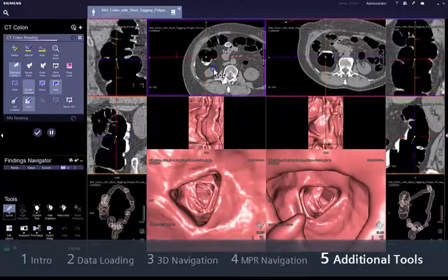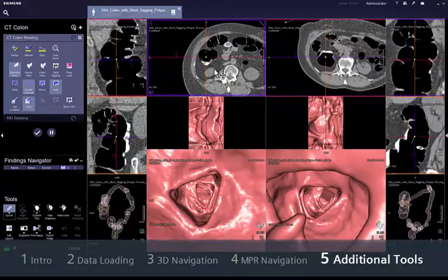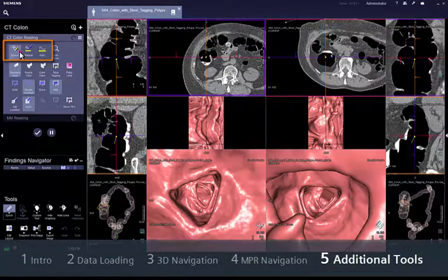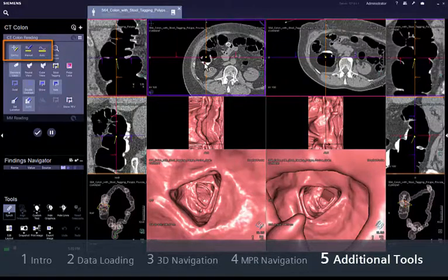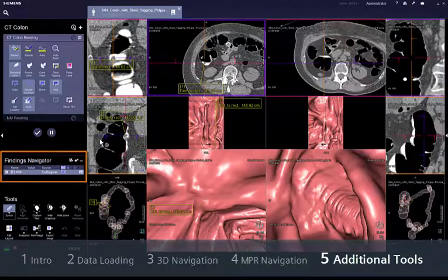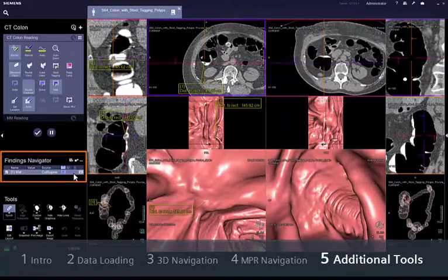If you find a potential lesion, you can either mark it or measure it in 2D or in 3D. In any case, a finding will be created in the findings navigator for further archiving. You can always come back to review the findings in the findings navigator.